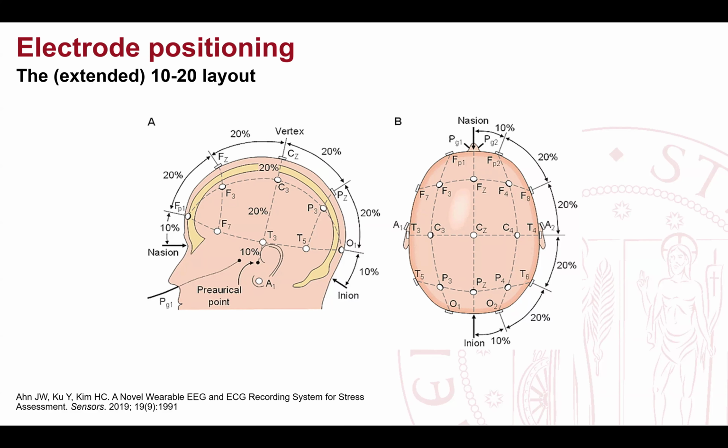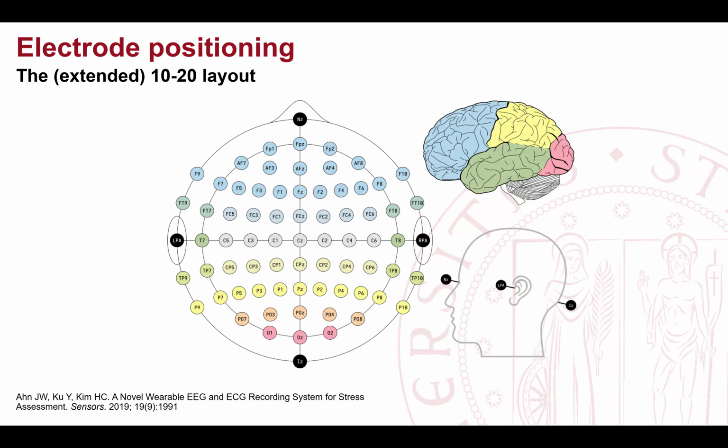Okay, and it can also have a different amount of electrodes. You may have smaller caps with 16 channels, bigger caps with 32 channels, or even more with 64, and normally up to 128 channels when they cover the whole scalp. But despite that, this I think is the 64 configuration. So these are 64 channels, which is normally the most used one, as it covers enough of the brain. And the electrodes are normally named according to the brain area that they cover.